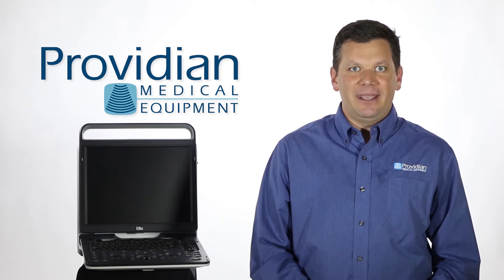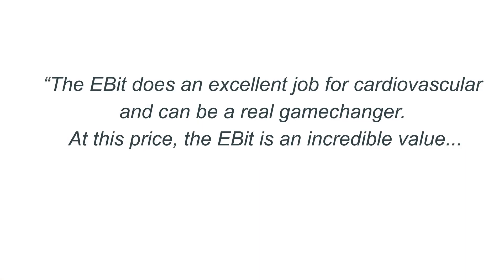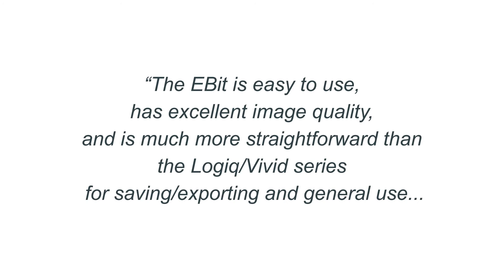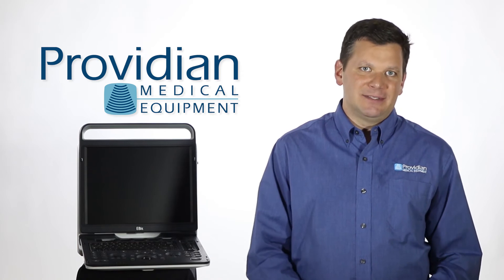Last week I tested the final beta, and afterward I wrote an email to our sales staff — quite different from what I sent the chairman. I said the EBIT does an excellent job for cardiovascular and can be a real game changer. At this price, the EBIT is an incredible value. It is easy to use, has excellent image quality, and is much more straightforward than the Logiq or Vivid series for saving, exporting, and general use. The cardiac image quality is better than others in its price range, comparable in vascular. Overall, the value of the EBIT cannot be ignored — and that's why we like the Chison EBIT 60 so much.